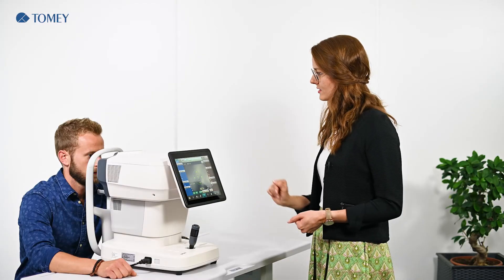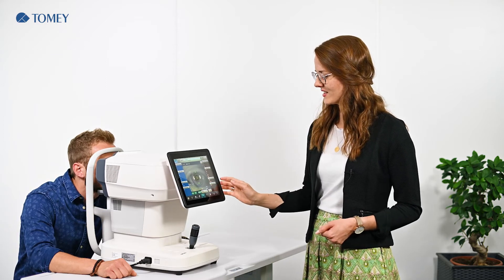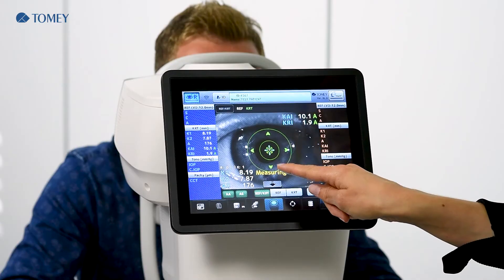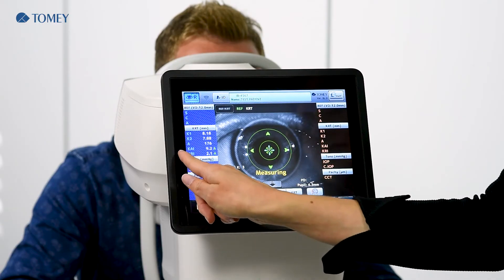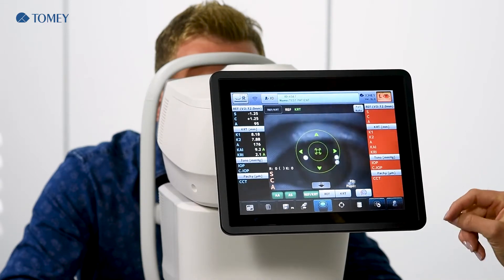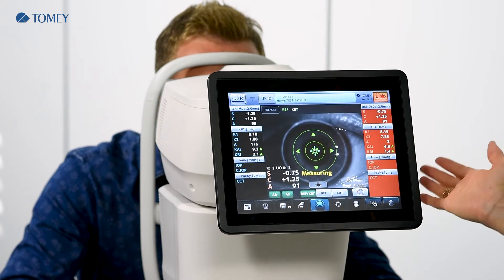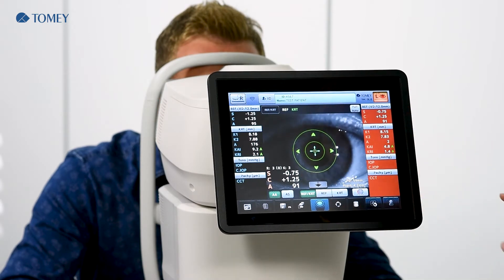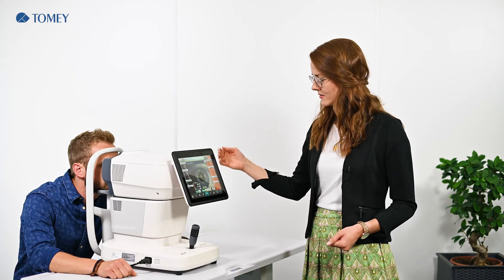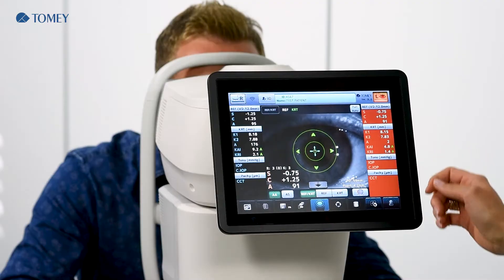So then our patient, please come in front. You see that the device already takes the measurement — first the keratometer and then the refraction. Thanks to the auto alignment and the auto shot, you don't have to touch anything else. Now our first two steps are done: refraction and keratometer are taken. We go to the mode change.